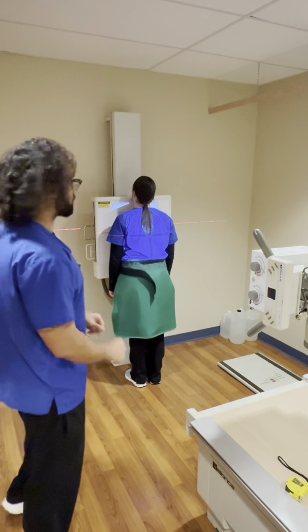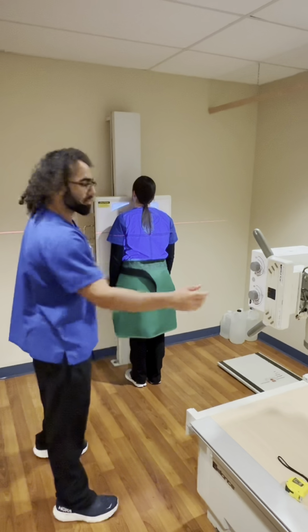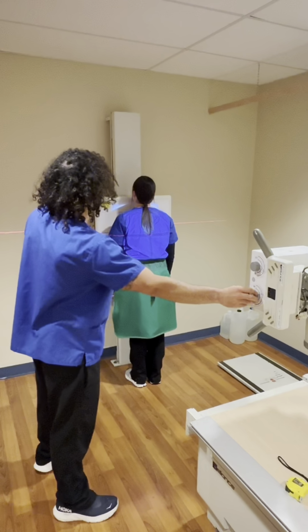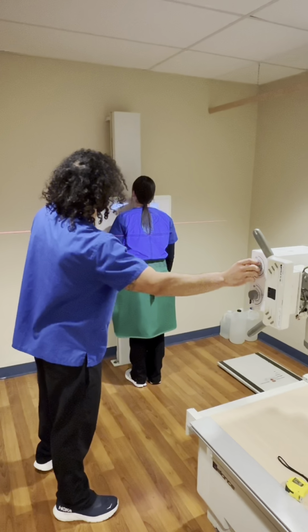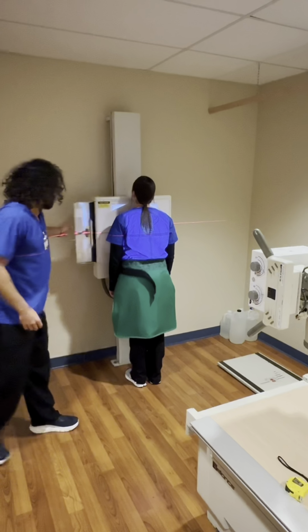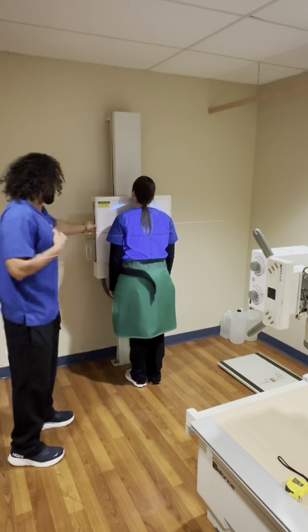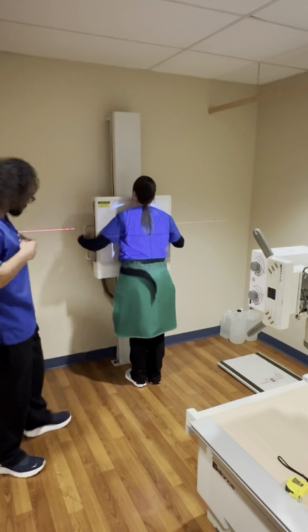you can start positioning your patient. So for a PA chest, you're going to have a patient with their chest up against the board here. And then you want to be centered at the level of about T7. So you just want some light above the shoulders here. We got our tube lined up to our bucky. I'm gonna have my patient reach around and grab the sides of the bucky here.